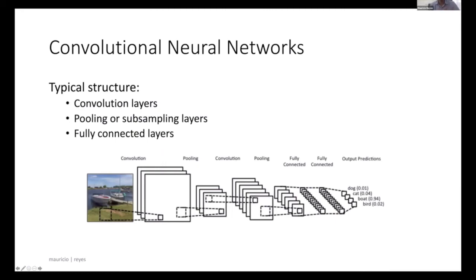Pixels are related. The relationship between neighboring pixels brings information, right? It's actually also what makes texture very interesting for convolutional neural networks. And then we have a network that has different layers, and different layers are also coded to do different things.